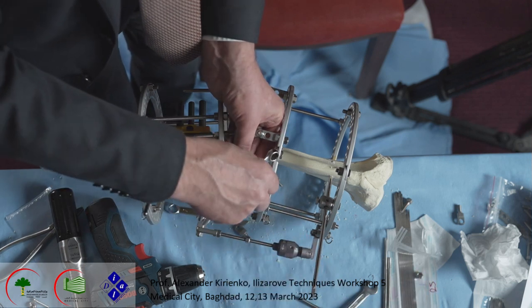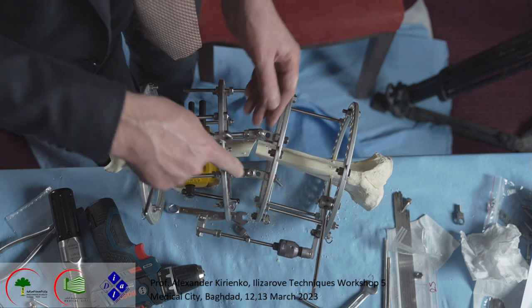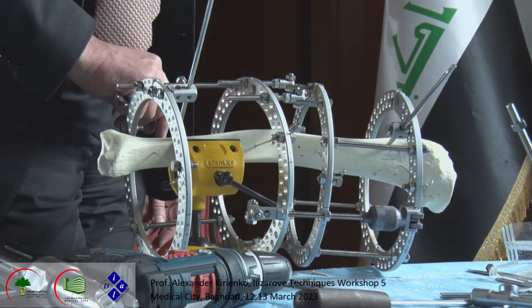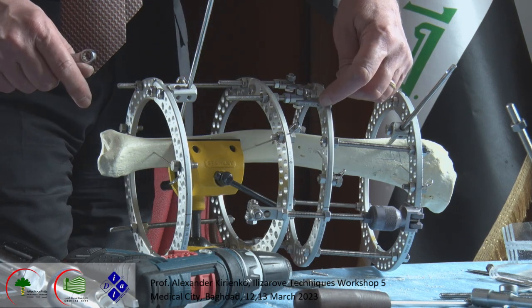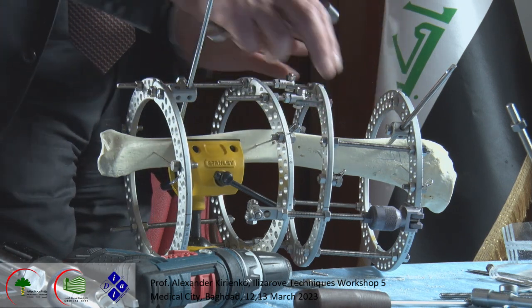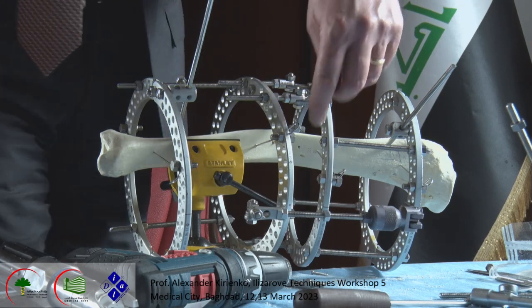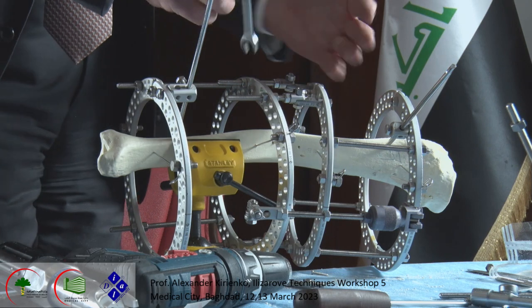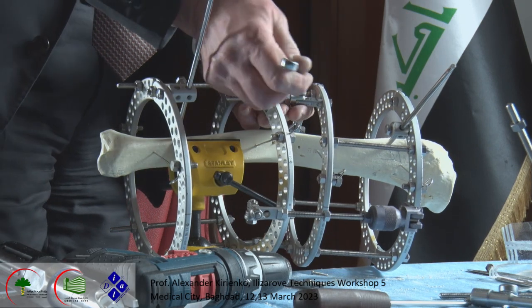If the deformity is like this in the beginning, not so much deformity, it is possible to do this kind of system. You see, maybe a little bit more distanced because in this way it is distributed better. One here, one posterior, and this motor functional. With this big inclination, it was not so easy to put it.